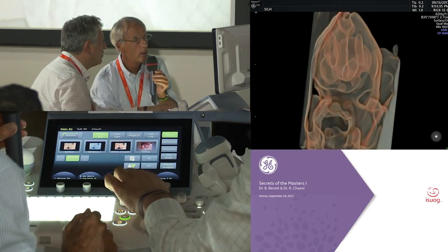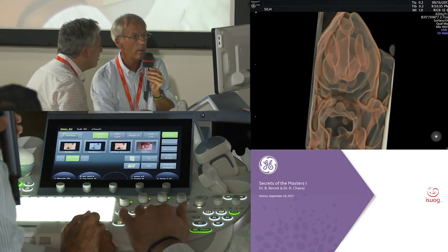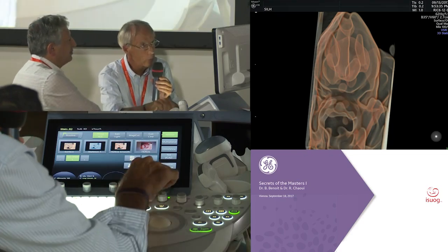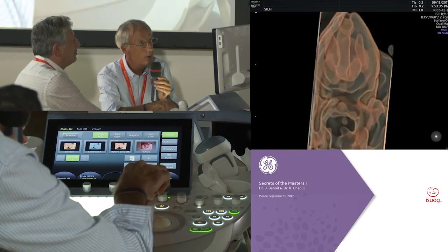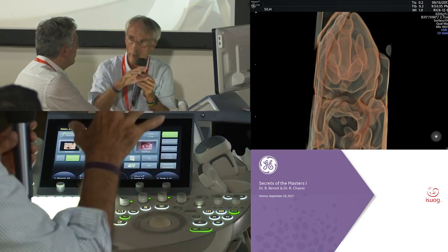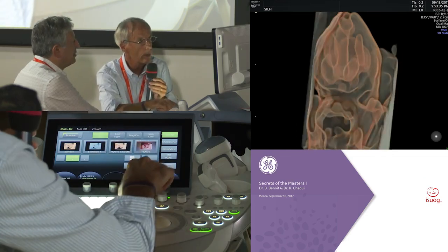So theoretically, in case of holoprosencephaly, you see here only 1. And what you can see here, because I saw some paper with it, this is not liquid inside the brain, it's a pericerebral space. Okay?